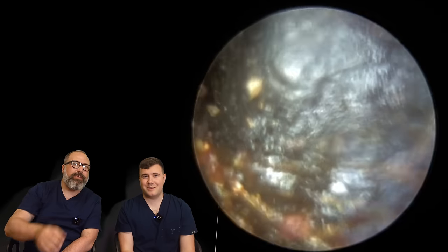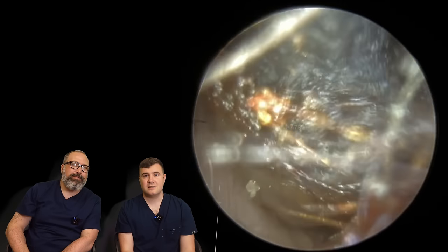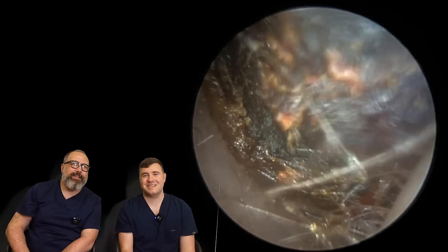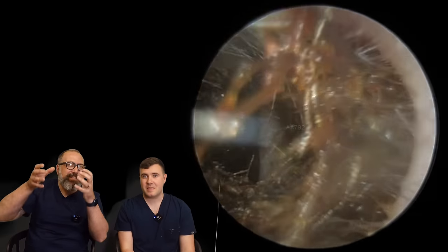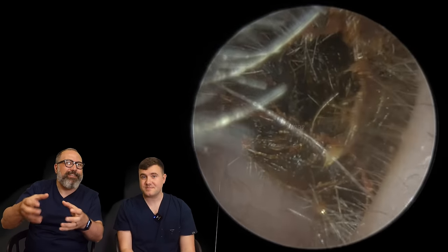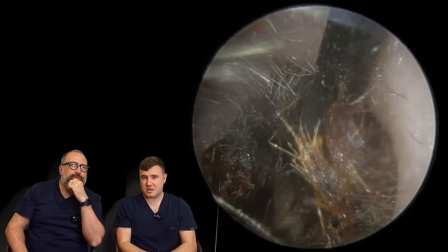Slow and steady. Look at that going away. That is a good plug. Just throughout the end — too much pressure and it just breaks away those little bits. I think it just stuck at the entrance of the canal and it just pulled through. You can almost see this kind of like a donut shape, or shoe shape.